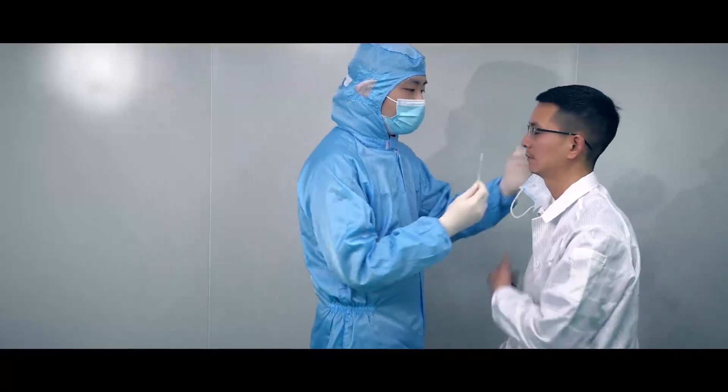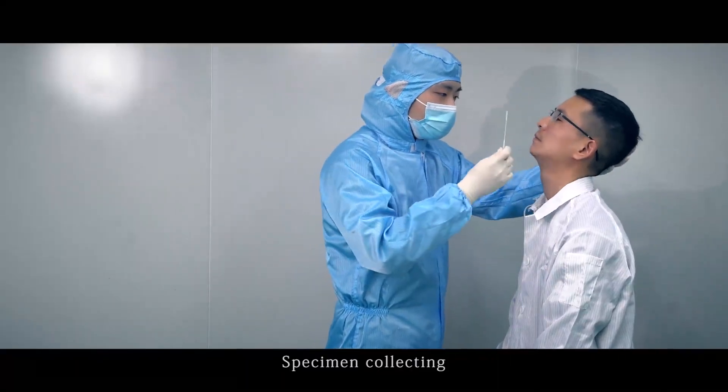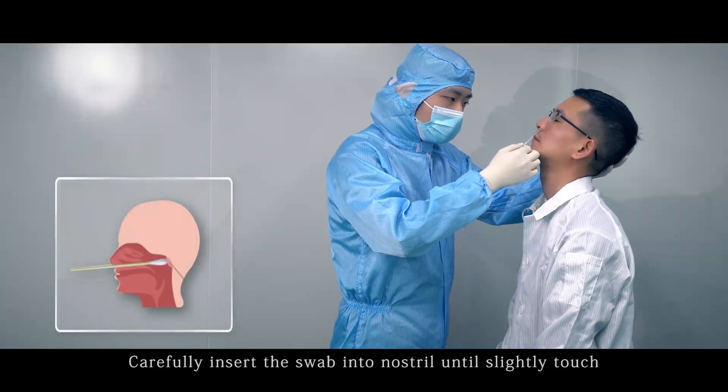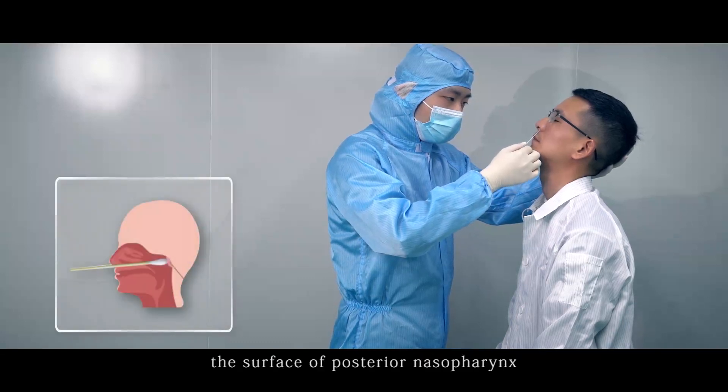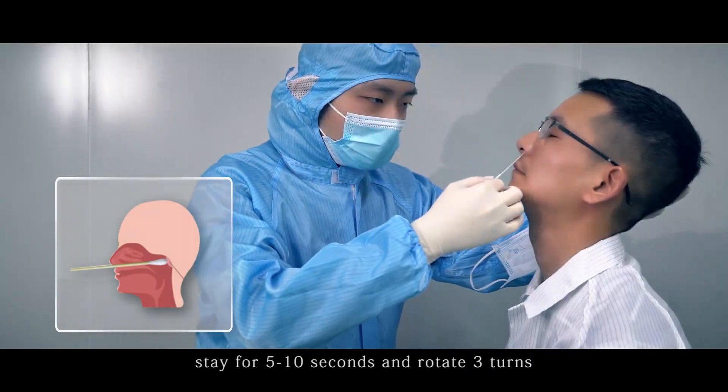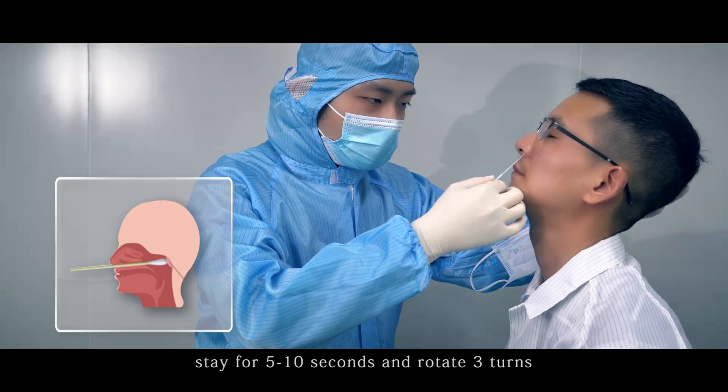Sampling of nasopharyngeal swab specimens. Specimen collecting: Carefully insert the swab into nostril until slightly touch the surface of posterior nasal pharynx. Stay for 5 to 10 seconds and rotate 3 turns.